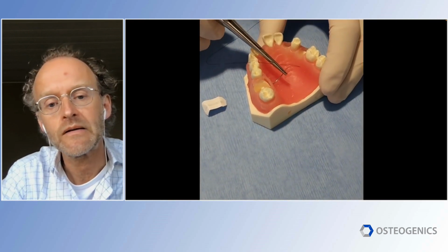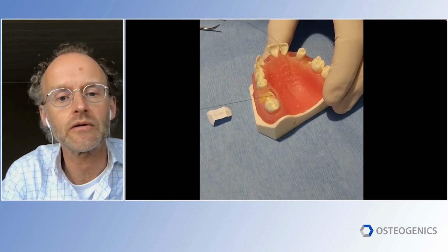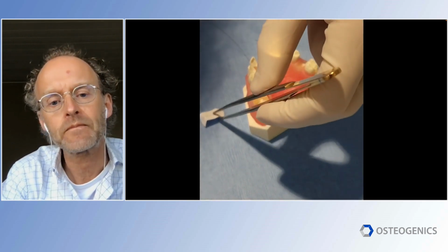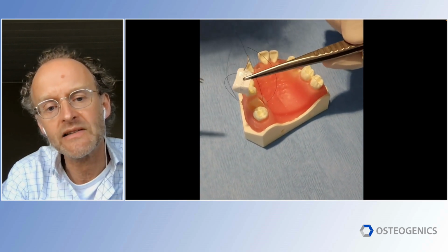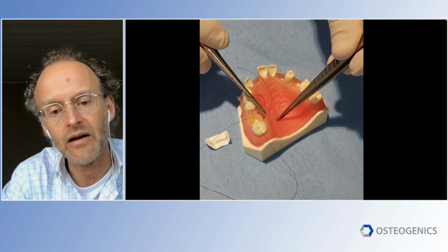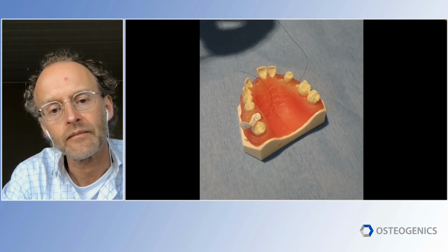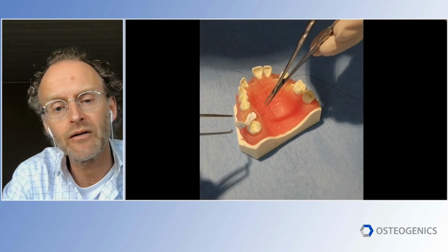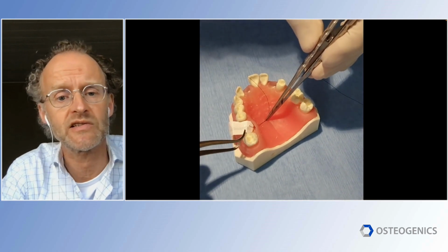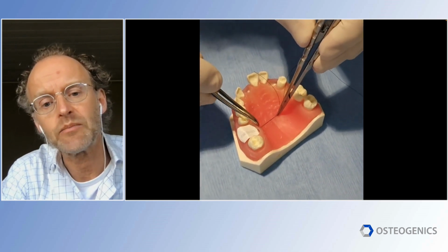I just show some. Another technique which you can use to get the membrane into this envelope is a kind of retraction suture, as I call it. So first you go from the palate to the inside, and your entrance point should be quite apical. Then you pick up the membrane and you go from the inside to the outside. You go back to the palatal tissue, again in a very apical region, and get the needle out. Then you take your needle holder and you get grip of both sutures, and you can pull gently, or your assistant can do that. And here you see with the surgical tweezers, you can get it in and pull it into the deeper part if you want to.